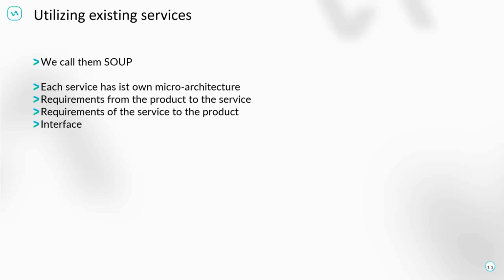So be very precise that each SOUP is not only in your risk analysis and in your documentation, each manufacturer of a SOUP will also be part of your supplier file, which sometimes is a bit weird because then you will have the Linux Foundation as a supplier. You don't have anyone to claim from.